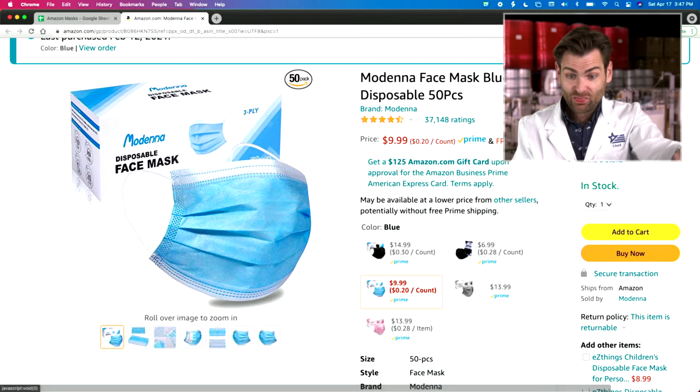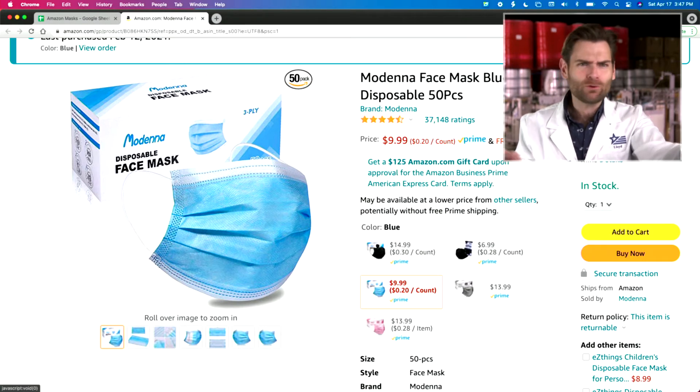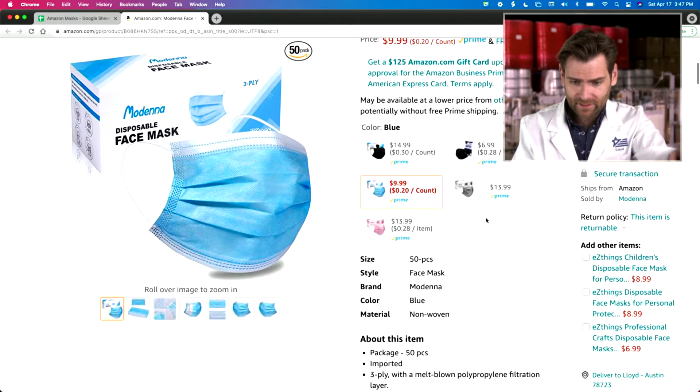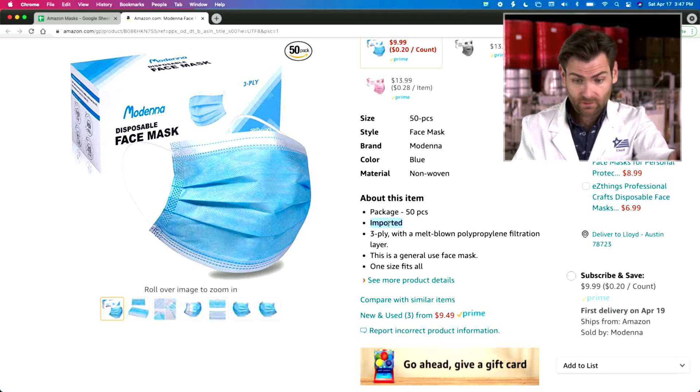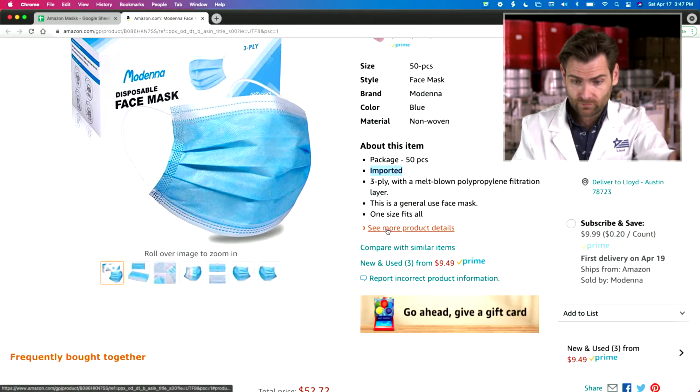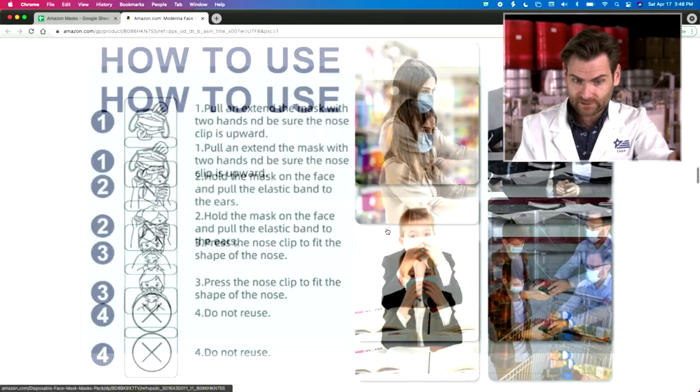Let's look at the listing. Modena — not Moderna — brand, 37,000 ratings. Geez, people. $9.99, great price. No claims on the box. Imported. General use face mask, one size fits all — I don't know about that. They made a pretty good mask and they're upfront about everything. But how's it going to test? Let's check it out.